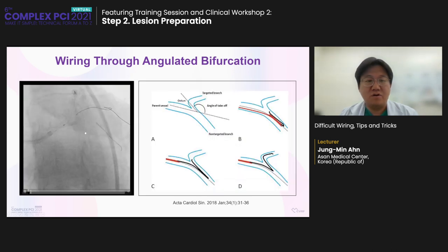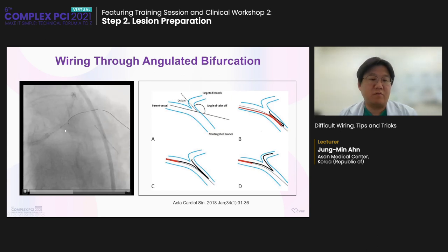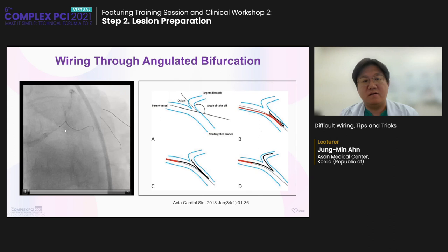I would like to introduce the reverse wire technique like this. Make a long bend using the dual lumen microcatheter and push it to the distal, then slowly pull back, and you can go into the reverse angle, the side branch, like this. This is a very useful technique for a very angulated bifurcation.